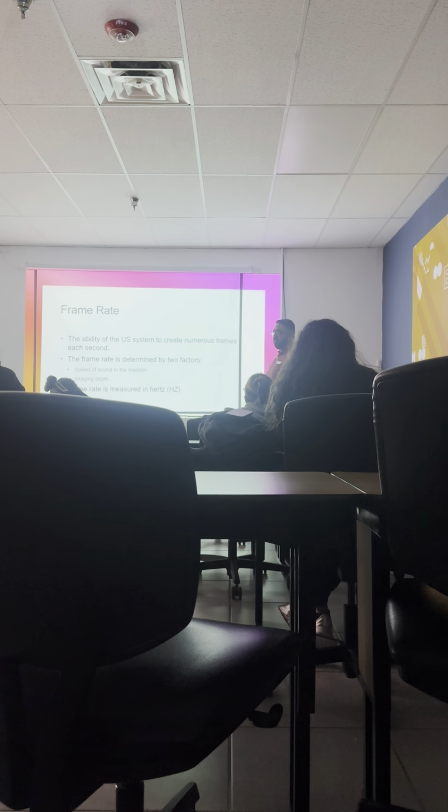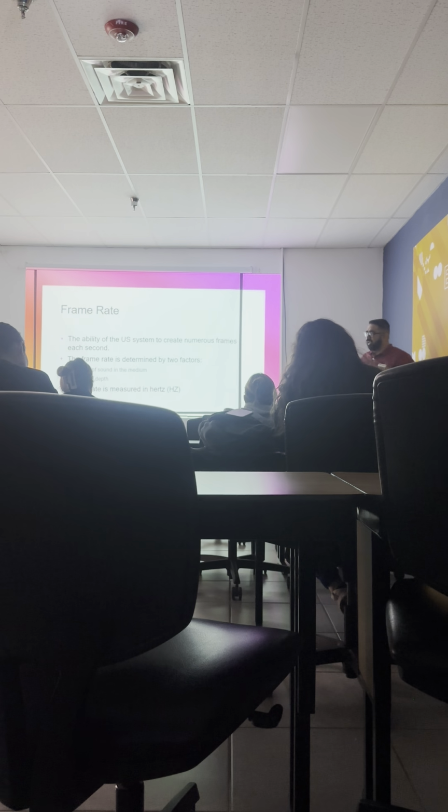Okay, now frame rate. Do you remember frame rate? We did this in the first physics. Remember? The number of images per second. Frame rate is the ability of the ultrasound system to create numerous frames each second. So if I make one frame in 1 second, what's my frame rate? What's my frequency? 1 hertz. Remember, I said seconds. Now if it can make 10 frames in a second, what's my frequency? 10 hertz. That's exactly what it is.